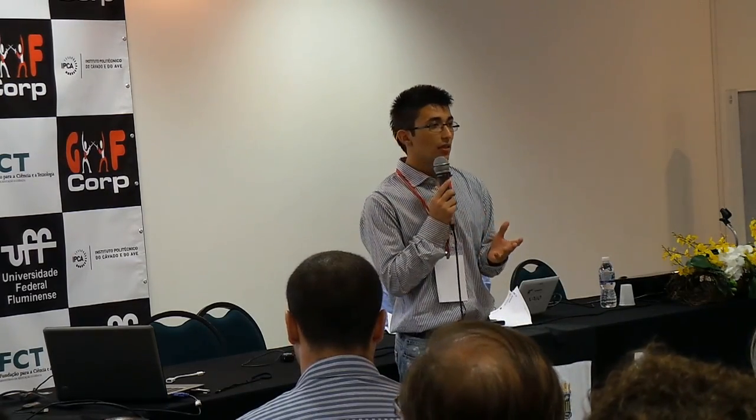Methodology. We have 3 inclusion criteria. One of them was to have monoparesia in the upper limb caused by sequelae of stroke, traumatic brain injury, or cerebral palsy. The second one, to be able to be in a standing position at the moment of interacting with the video game. And the third one, to have 50 or more degrees of shoulder flexion. According to these criteria, 6 patients were taken into consideration: 2 patients with sequelae of stroke, 2 patients with sequelae of cerebral palsy, and 2 patients with sequelae of traumatic brain injury.